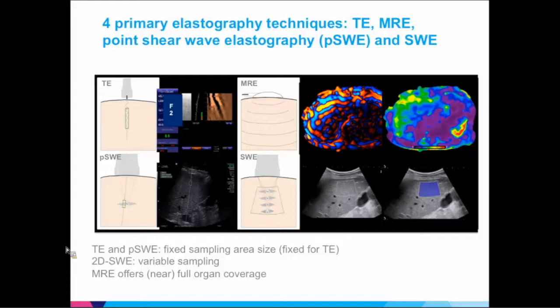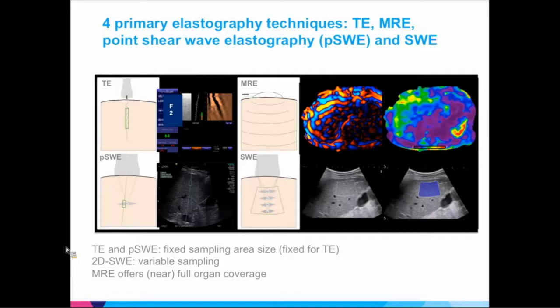You can see coverage difference between TE and SWE. With PSWE or SWE, you have a larger area of excitation with transverse shear wave propagation and a much larger area of interest. You can vary the area. A problem with both ultrasound methods is that you cannot measure deep in the liver — vendors tell you not to measure more than about 3 cm deeper than the capsule of the liver, as anything deeper would be unreliable.